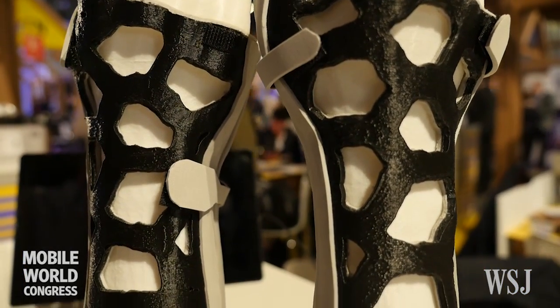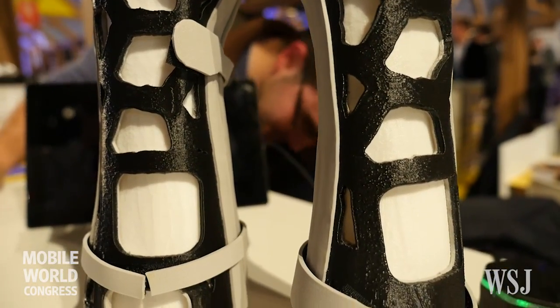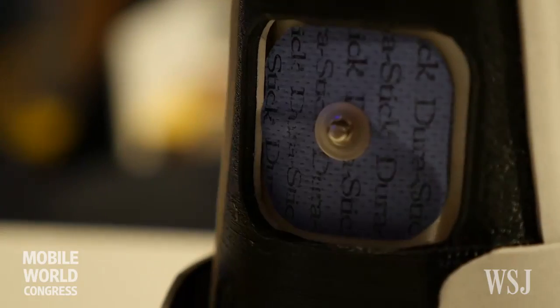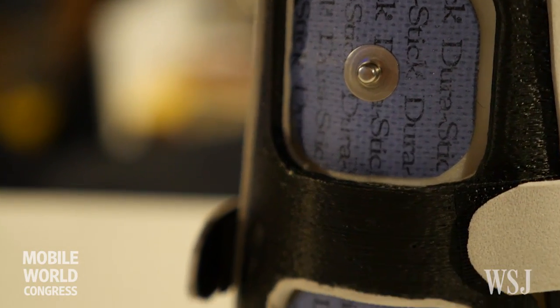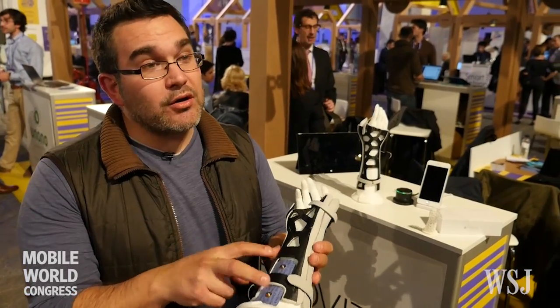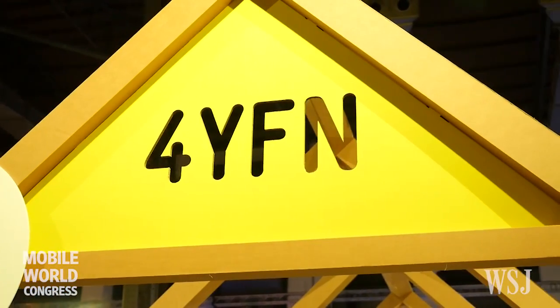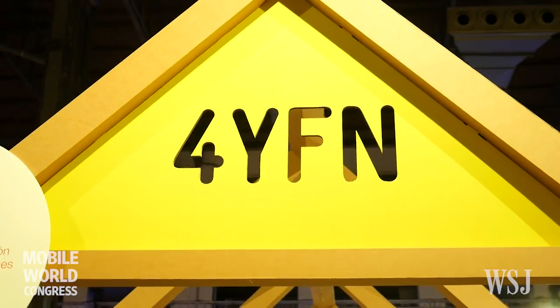This is a special kind of 3D printed cast. The patient can scratch themselves, take a shower, and it's easy to use scanner technology. Using an electro-stimulation device we can control what's going on with the treatment, and this is good because we can start the treatment before removing the cast. We save money and time for everyone.